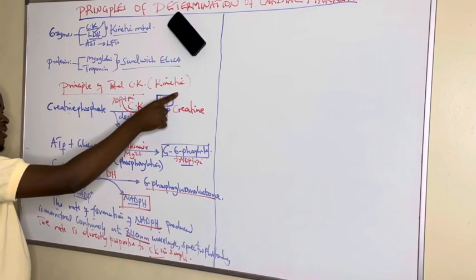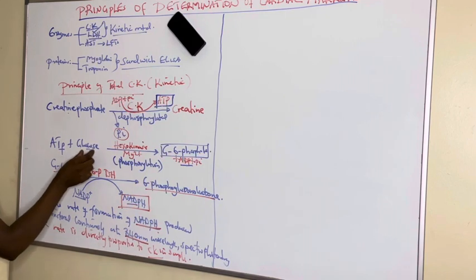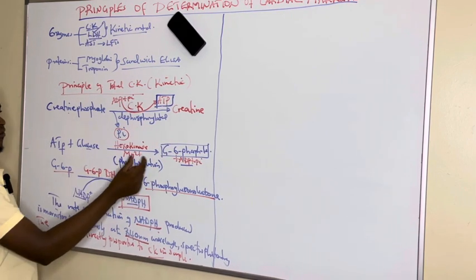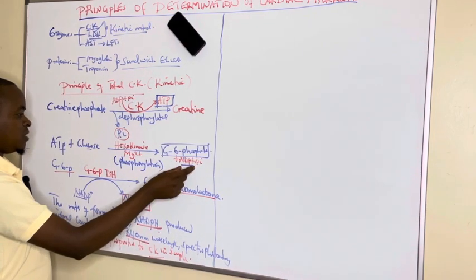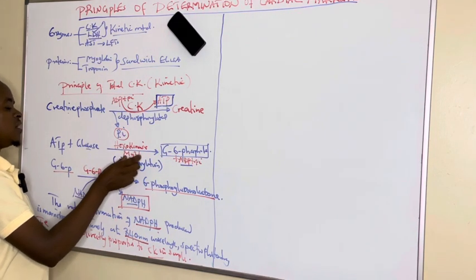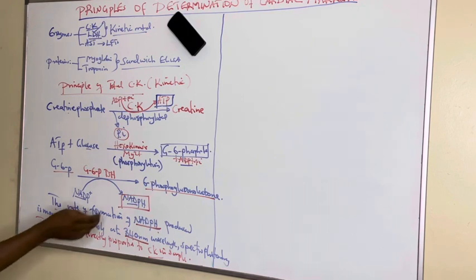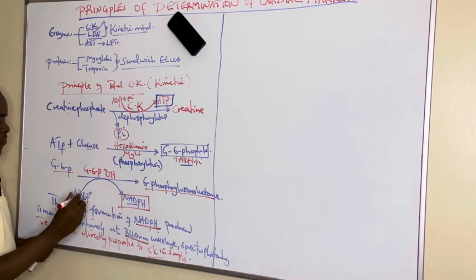The ATP produced reacts with glucose at carbon number 6 and adds the phosphate group, forming glucose 6-phosphate with the production of ADP. The enzyme that catalyzes this reaction is hexokinase, in the presence of magnesium as a cofactor. But after producing glucose 6-phosphate, it is oxidized. This reaction is an oxidation reaction.